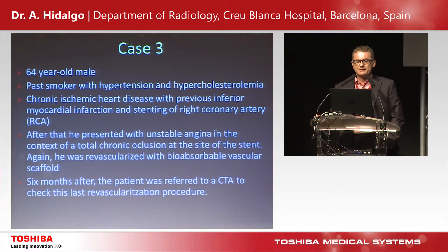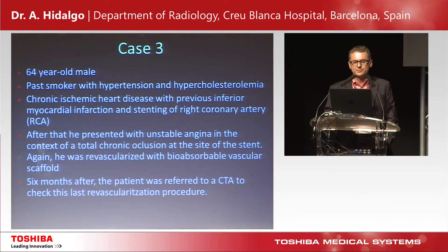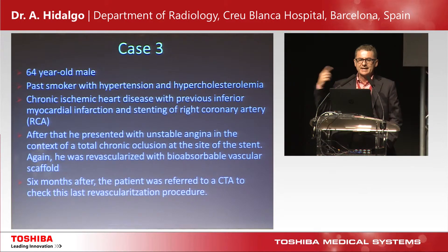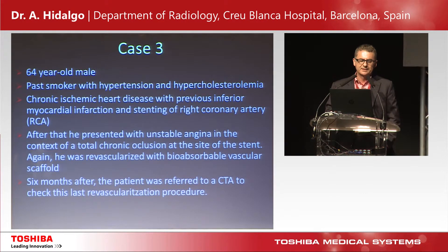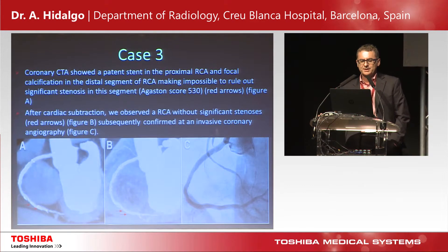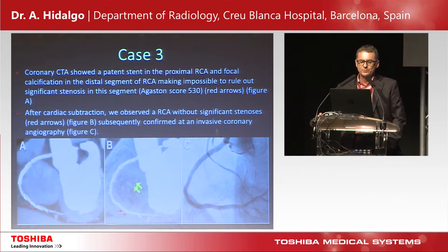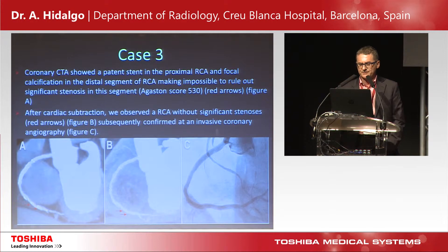This case involves a patient with chronic ischemic heart disease, a previous myocardial infarction, and a stent in the RCA who now presents with unstable angina in the context of a chronic total occlusion at the stent site, which was revascularized. Six months later, he was referred for a CTA to assess the result of the procedure. You can see the stent here, and while it is difficult to evaluate neointimal hyperplasia initially, after removing the stent with subtraction some neointimal hyperplasia is visible, though the lesions are not significant — confirmed by correlation with invasive angiography.